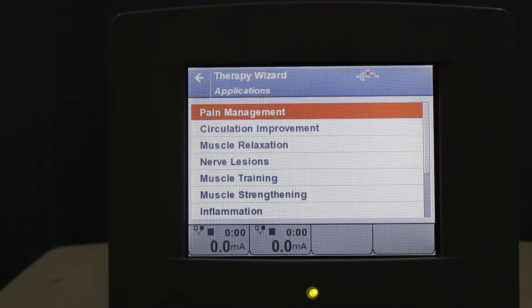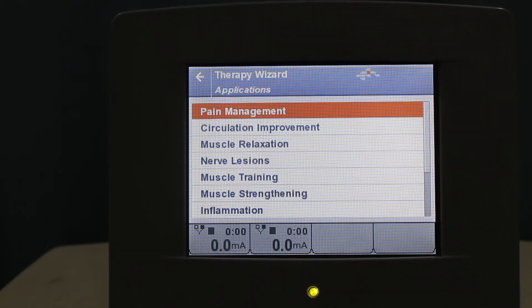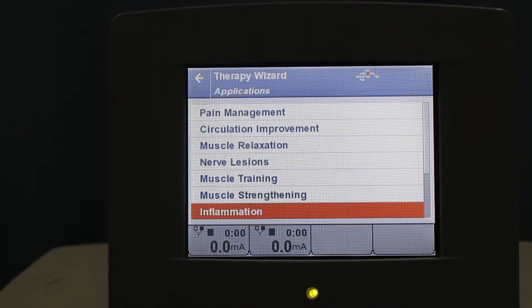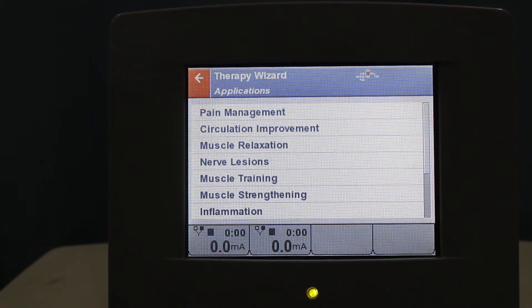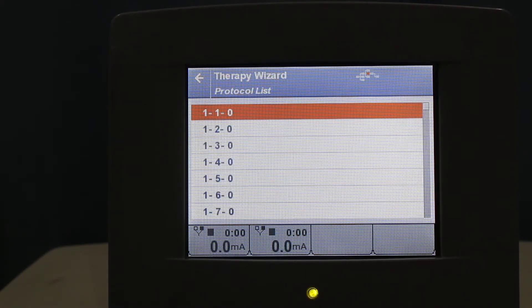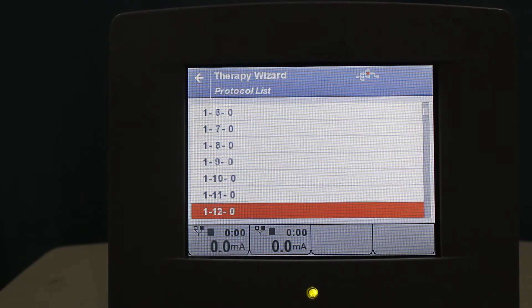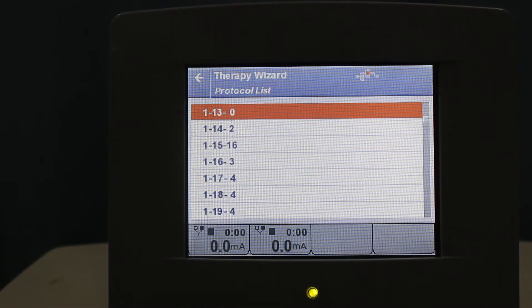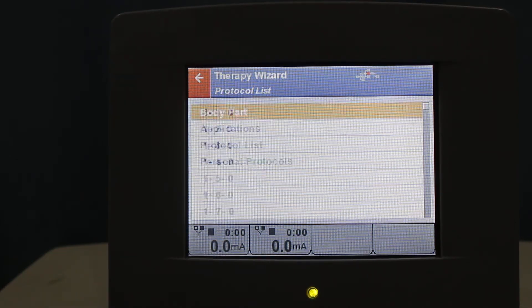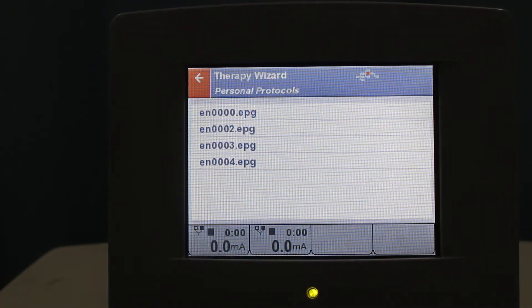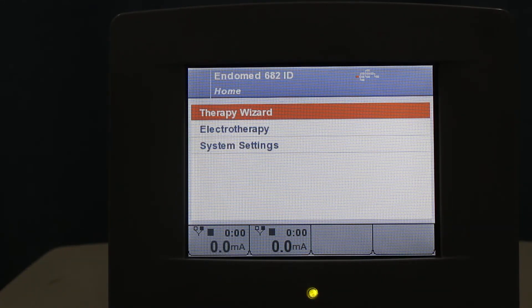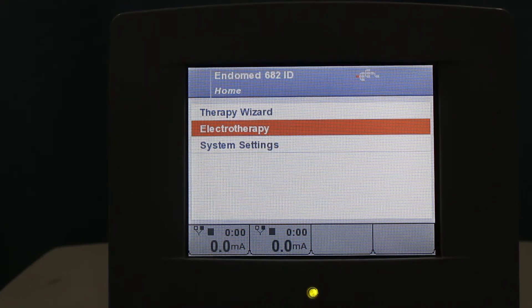You can also select the applications for pain management, circulation improvement, nerve lesions, or muscle training — any of the menu options can be chosen. From the protocol list, this is by default the protocol available in the manual. Personal protocols are safe protocols that you can save for your patients.